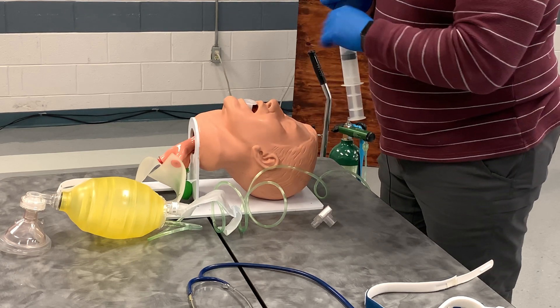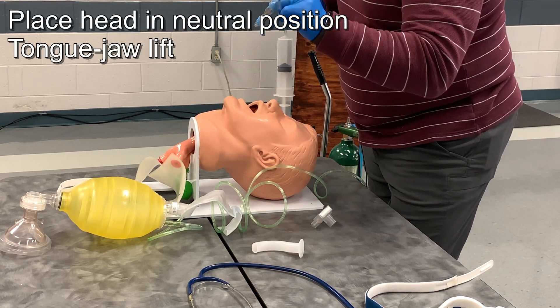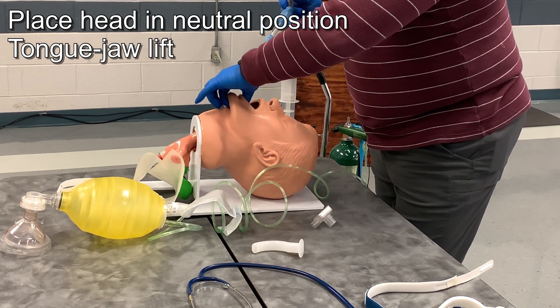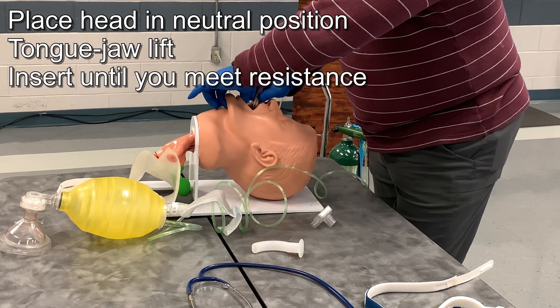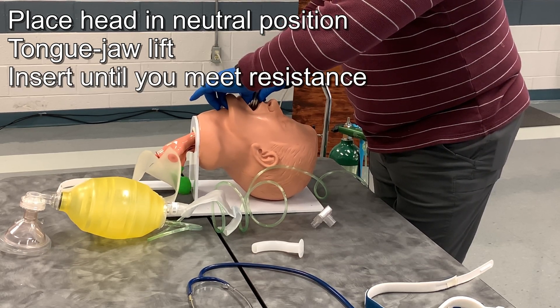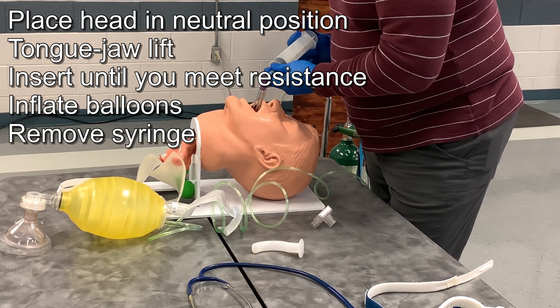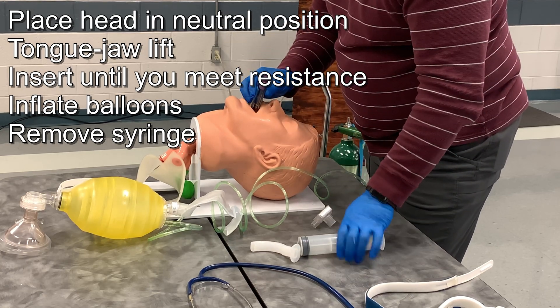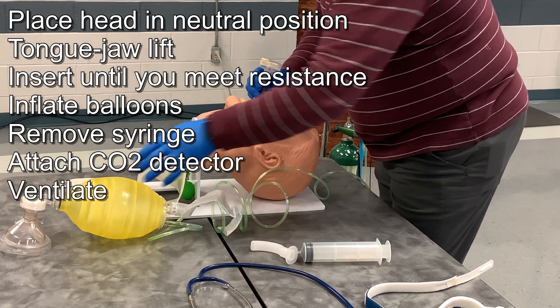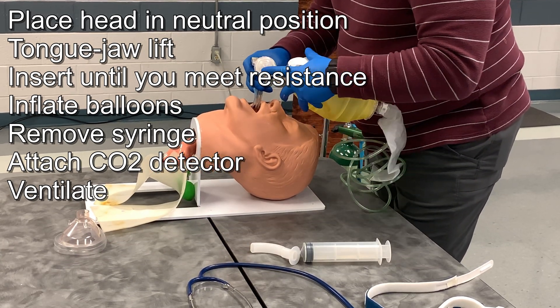I am now ready to insert it, so my partner will stop ventilations. I will remove the OPA using a jaw-tongue lift, clear the airway, and insert this until I meet resistance — it does not want to go any further. At that point I will inflate the balloons, remove the syringe, attach my end tidal CO2, and begin ventilating.